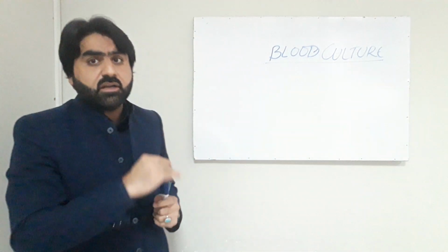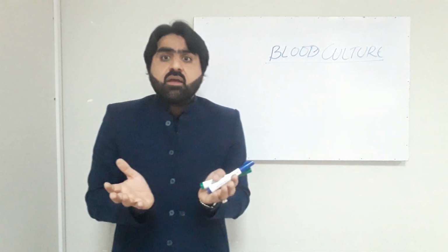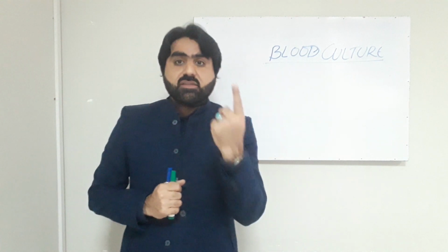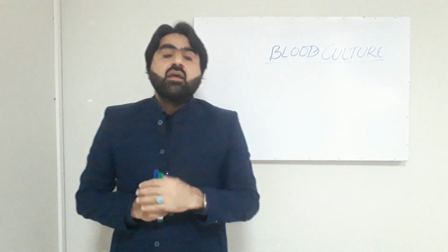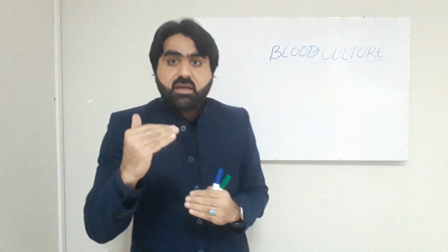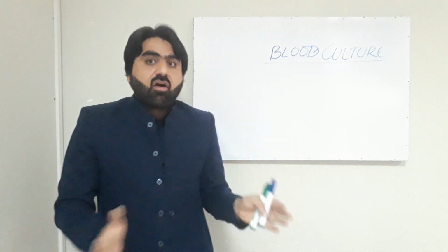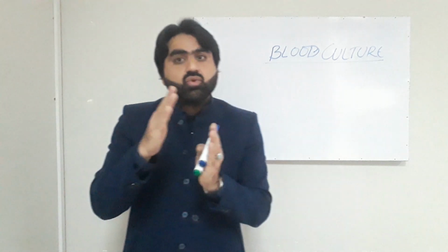In case of children, because the whole blood present in the body is very low, the minimum requirement is 1 blood culture set, but it can be increased by keeping in mind the situation of the patient. So it can be increased from 1 blood culture set to 2 or 3.